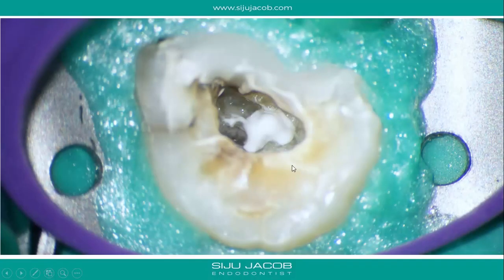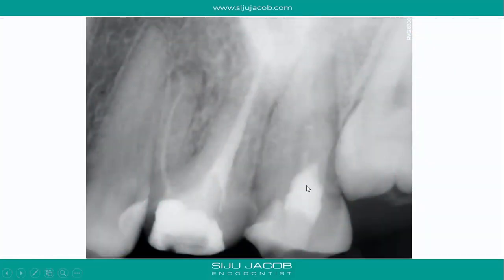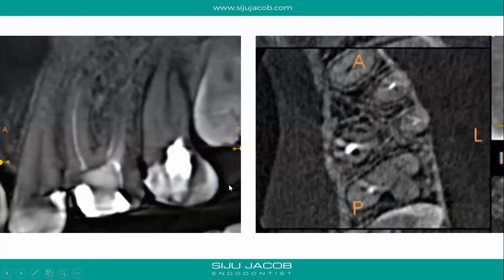I put calcium hydroxide into the canal I'd found, placed a temporary filling, and decided to take an inter-appointment CBCT. On the radiograph it looked like a single canal, so I wasn't sure what to do. On the cone beam CT it was pretty clear there was distinctively a mesiobuccal and a distobuccal root that were untouched so far, and you could see the calcium hydroxide sitting in a distinctive palatal canal.